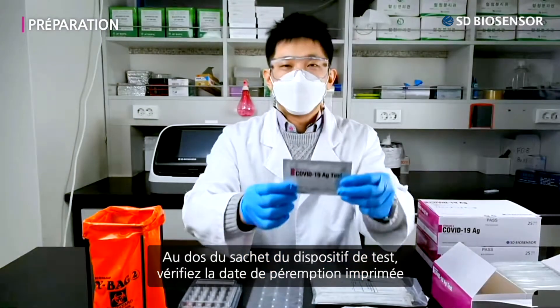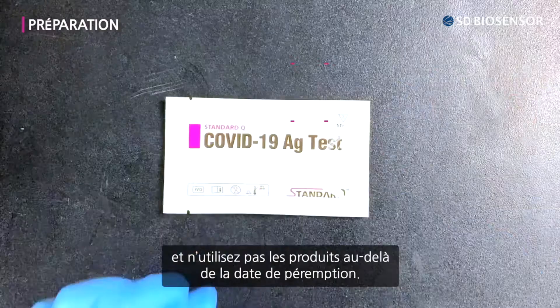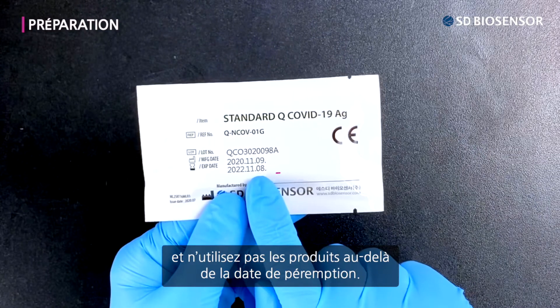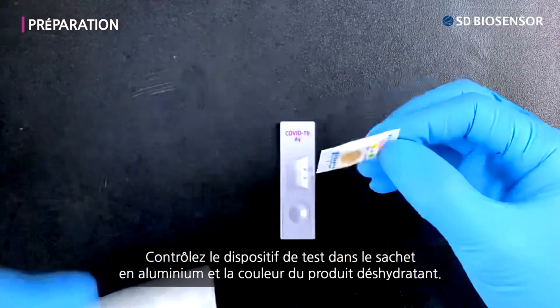On the back of the test device pouch, confirm the printed expiration date and only use products before the expiration date passes. Please confirm the test device in the foil pouch and the colored signage of the desiccant.